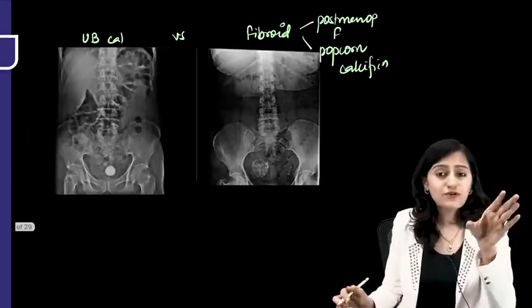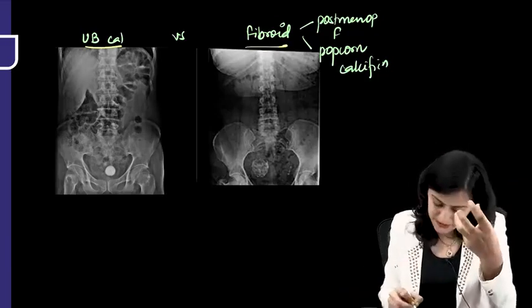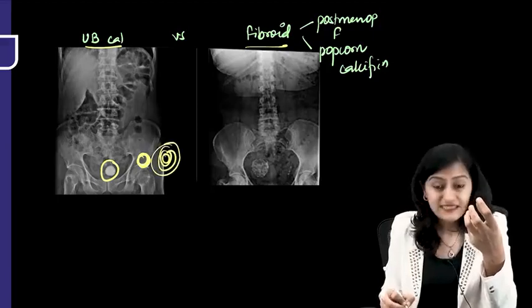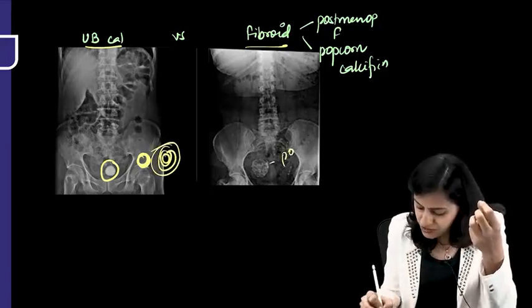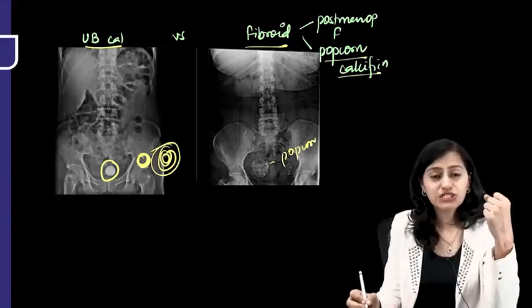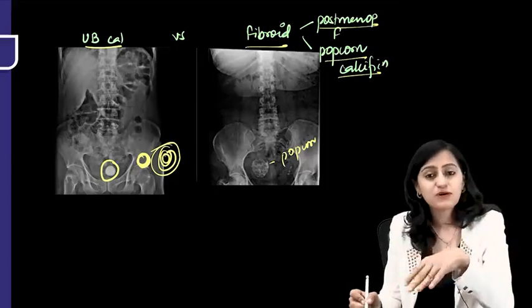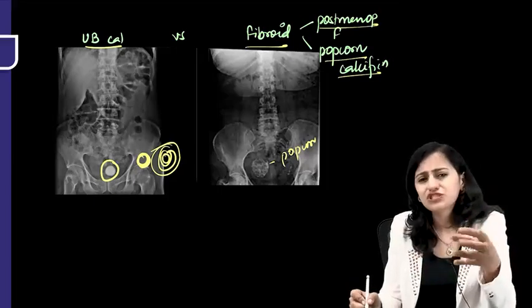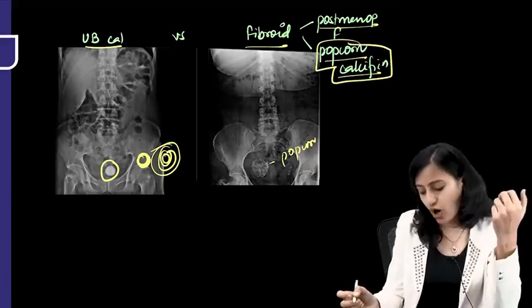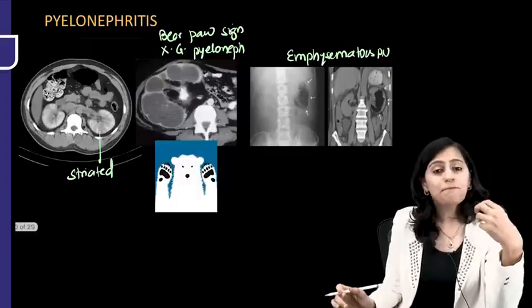Right? Now, how do you differentiate whether it's a bladder calculus or a calcified fibroid in the X-ray pelvis? A bladder calculus will be dense calcification or lamellated calcification. Fibroid will show this popcorn calcification, a previous FMG exam question. So there the history would be a postmenopausal female. Now in postmenopausal, the fibroid undergoes involution, degeneration, calcific degeneration. So that is popcorn calcification. The stippled or the popcorn calcification is what we see.